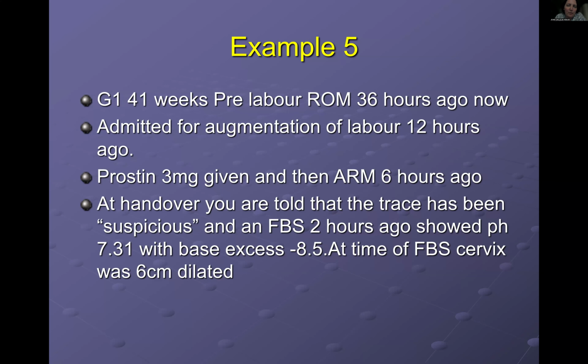Since she's been in labor for 12 hours, there has been a change of shift. At handover, you're told that for the past hour or so, the trace has been looking suspicious, and they took a fetal blood sample. Basically, they nicked the fetal scalp and took a blood sample from there, which showed a normal pH, so it was kind of reassuring. And at that time, she was 6 centimeters dilated.